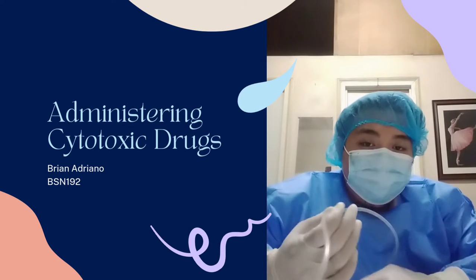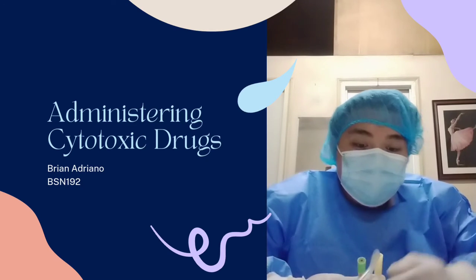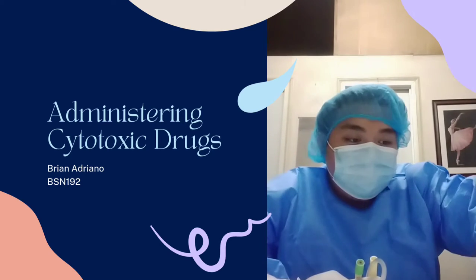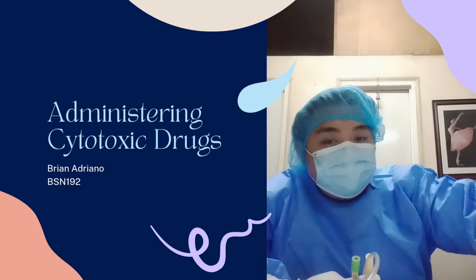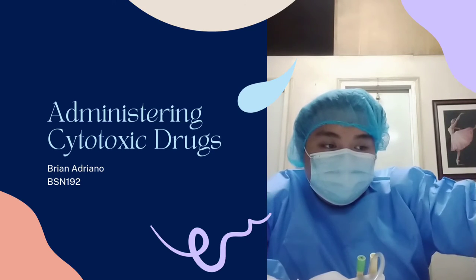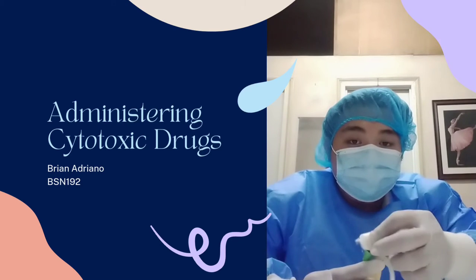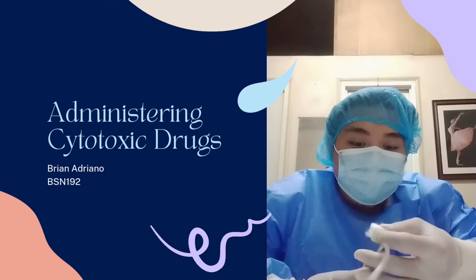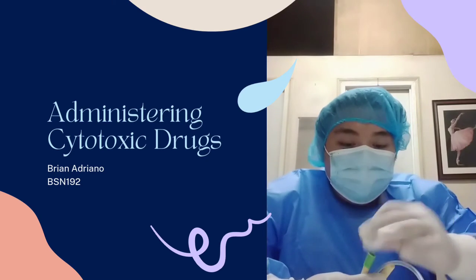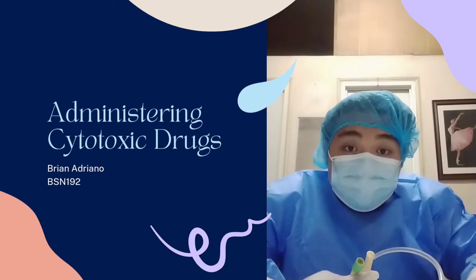So this is the IV line, and then this is the IV port and the drugs. Before we insert or push the drugs that are needed, using the alcohol swab, make sure that the IV port is clean before we input the cytotoxic drugs.